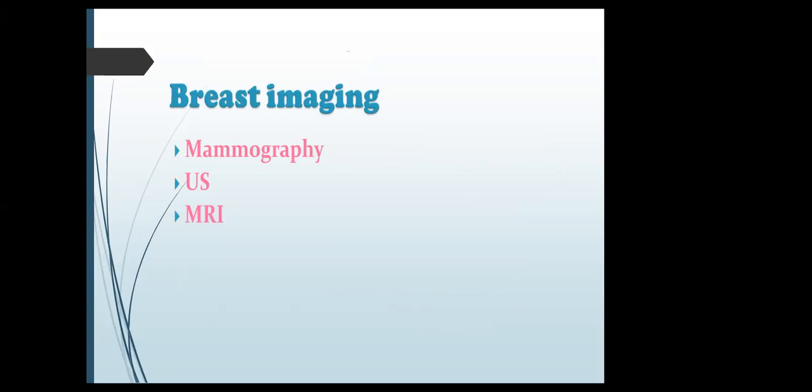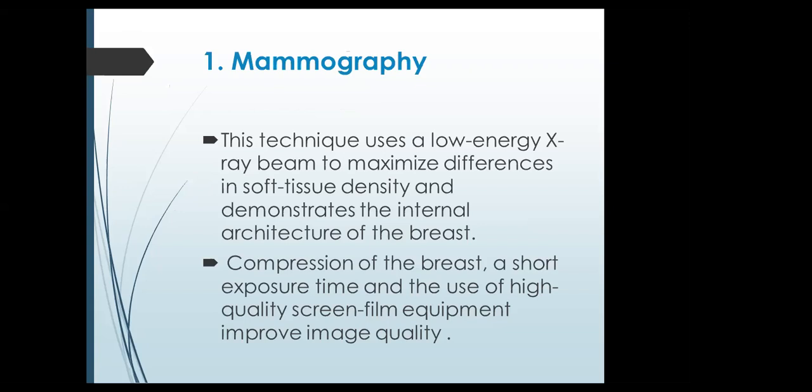Breast imaging. Now we have mammography, ultrasound, MRI, and other modalities. About mammography: this technique uses a low energy X-ray beam to maximize differences in soft tissue density and demonstrate the internal architecture of the breast. Compression of the breast, a short exposure time, and the use of high quality screen film equipment improve image quality.